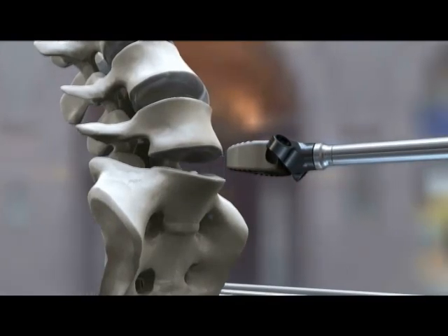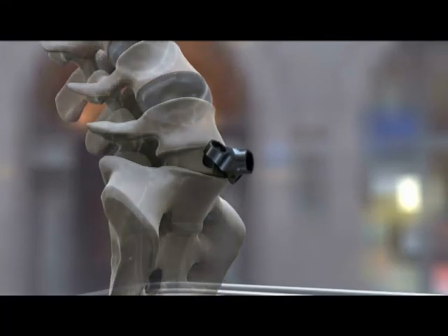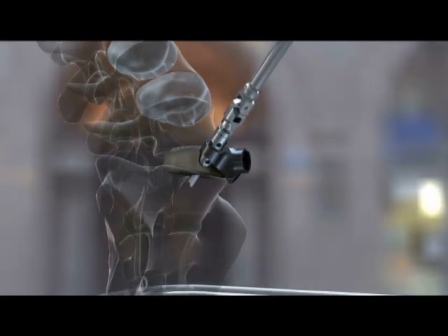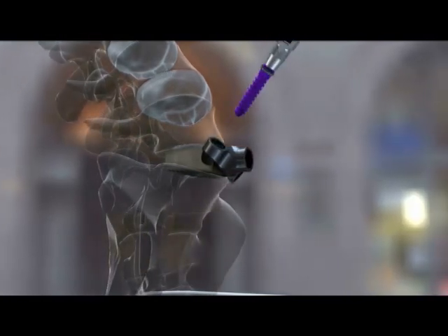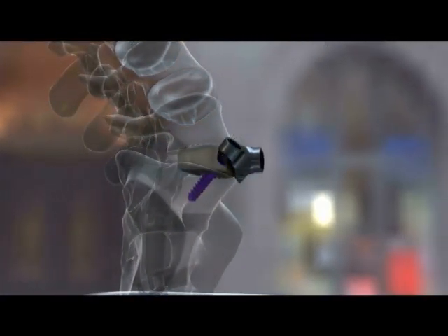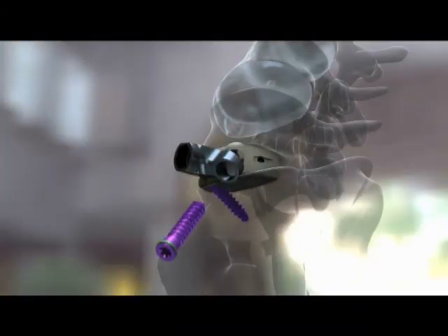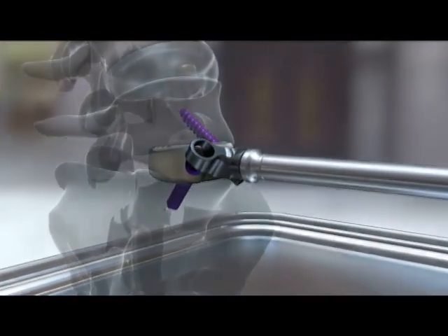In this situation, the option of a blade or two screws can be performed in order for fixation to the front of the spine. In the situation you see here, screws are being placed after the cage is inserted into the disc space. The way we do this is by placing the graft into the disc space and confirming x-ray placement, followed by using a drill, a tap, and placement of the appropriate size screw, one into each bone — the one above and the one below. This allows adequate fixation of the implant to the bone.